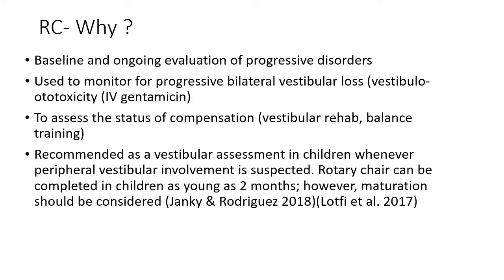It is also useful in testing children that will not allow caloric irrigation. So it's recommended as a vestibular assessment in children whenever peripheral vestibular involvement is suspected. It can be completed in children as young as 2 months. However, the maturation should be considered.